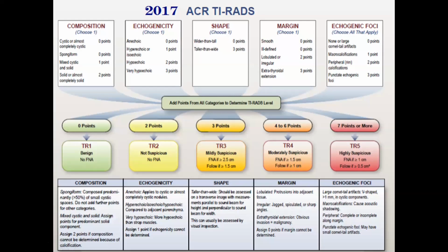So this is patterned after BI-RADS from breast imaging. And as many of you know, there's LI-RADS and even Lung-RADS. So there's this idea of going towards this grading system because it's very helpful for the referring physicians.